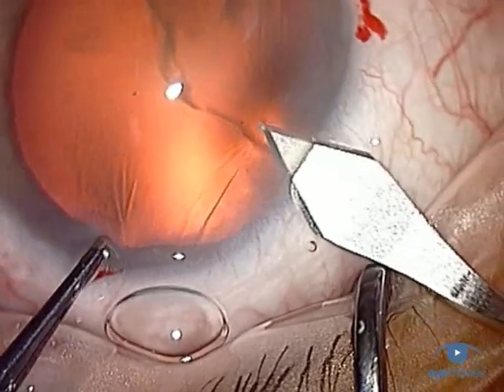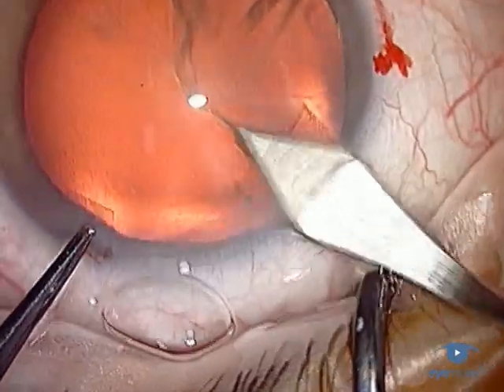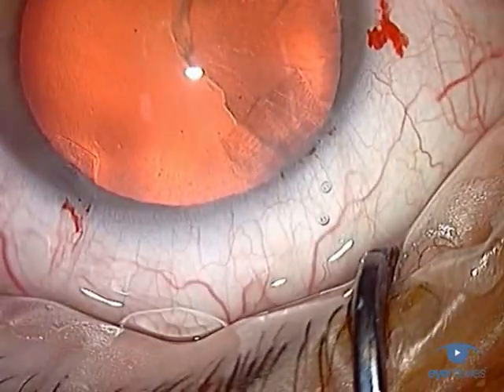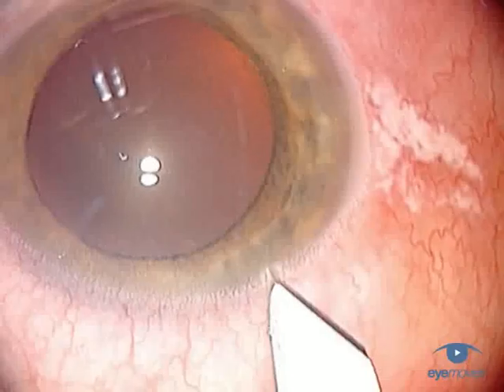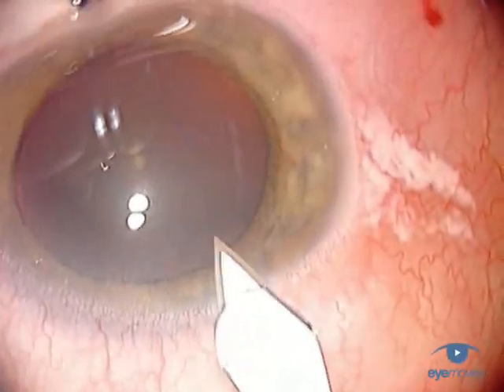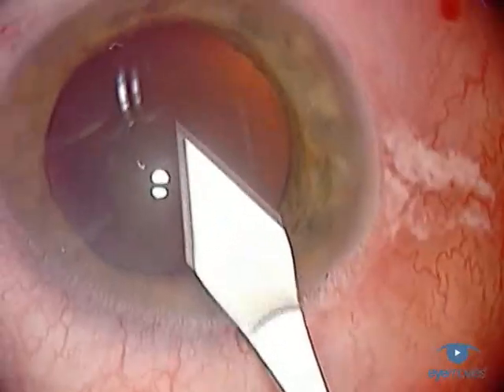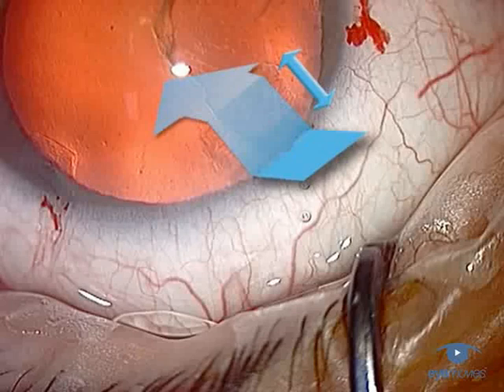The width, of course, is the easiest of the three to control because in most cases it's predetermined by the width of the keratome. The length and internal contour are more of a challenge. They require careful alignment of the blade and accurate control of its passage through the cornea in order to achieve consistent results. So now let's look at how to control the length and contour of the incision.